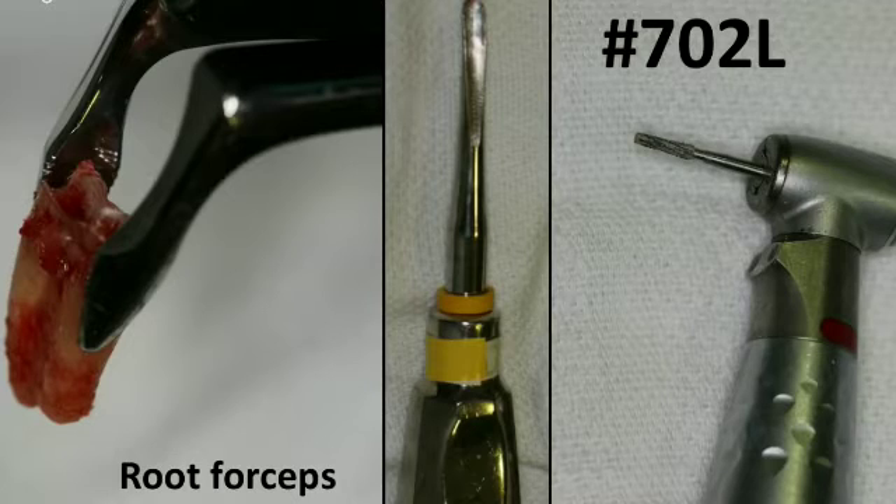When you section the root, make sure to be very careful not to go to the lingual plate. The buccal plate is already missing, but make sure not to damage the lingual plate. There's nothing wrong with stopping short of the lingual part of the tooth — number one, you can lose bone that is crucial for later on; number two, if you're dealing with second lower molars, you have to be careful of lingual nerve injuries. Know the anatomy and split only the root with minimal damage to the surrounding bone.